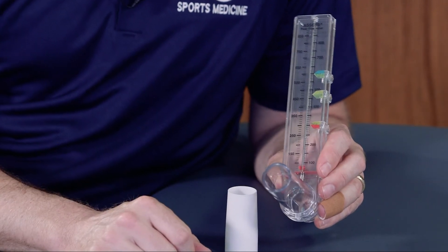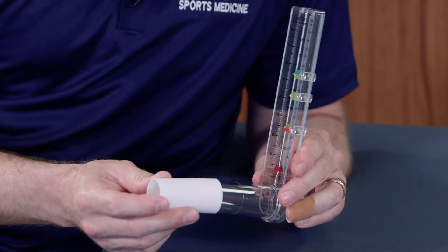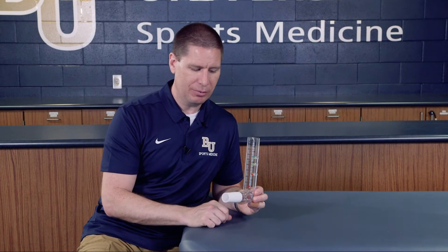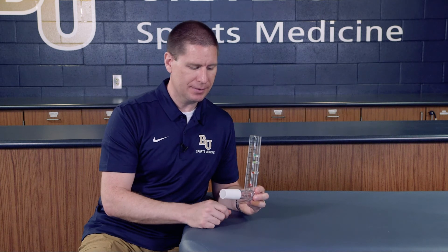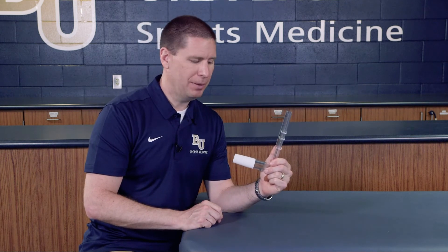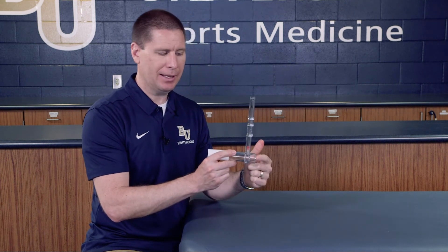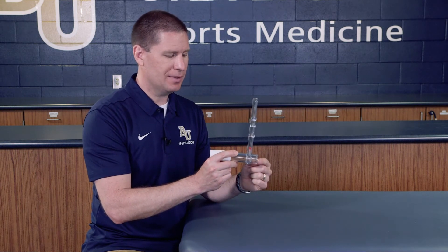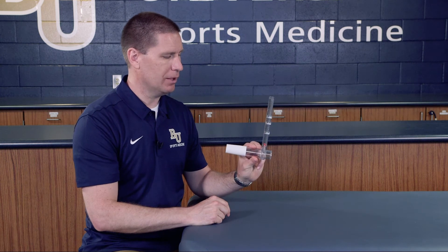We'd always want to do this when they're fully functioning and in a good position. This particular one has a mouthpiece you can place on there to make sure the same person isn't putting their mouth directly over the piece. One thing to make sure is that you don't hold the peak flow meter blocking where the air comes out on the back side, because that will create more pressure and give you a false reading.